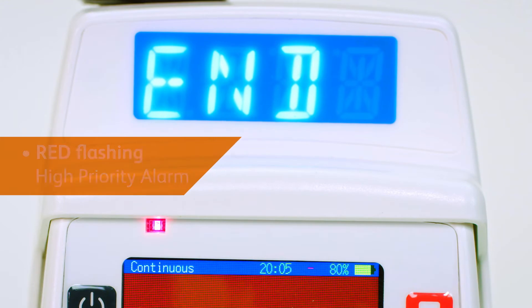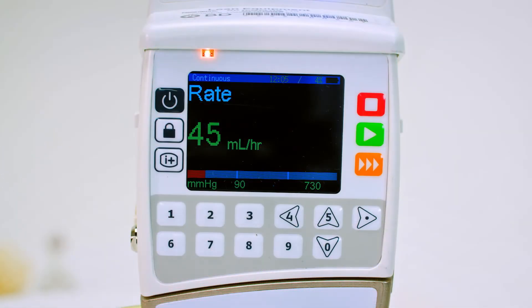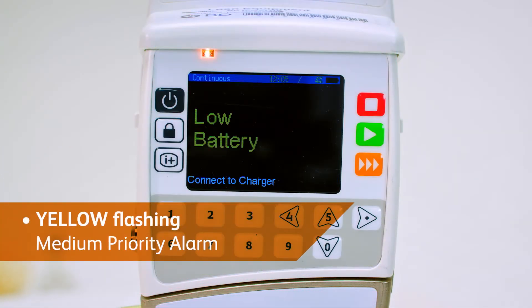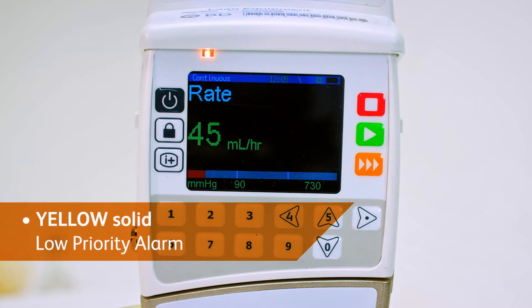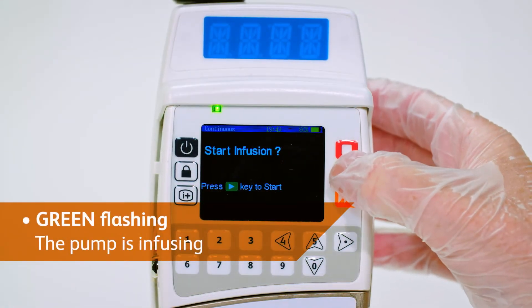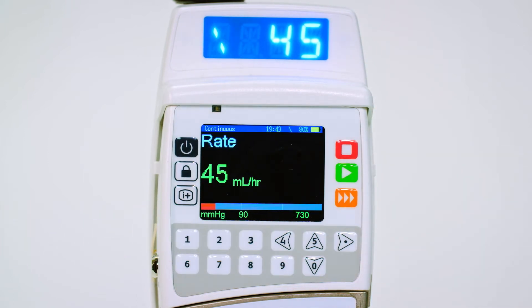When an alarm activates, the LED indicator will notify you of the urgency of the problem or status, using a red, yellow or green traffic light system. A flashing green indicator means the pump is infusing, whereas other colours and a continuous alarm will sound until the problem is rectified or the pump is paused. Make a note of the condition before stopping the pump to troubleshoot.